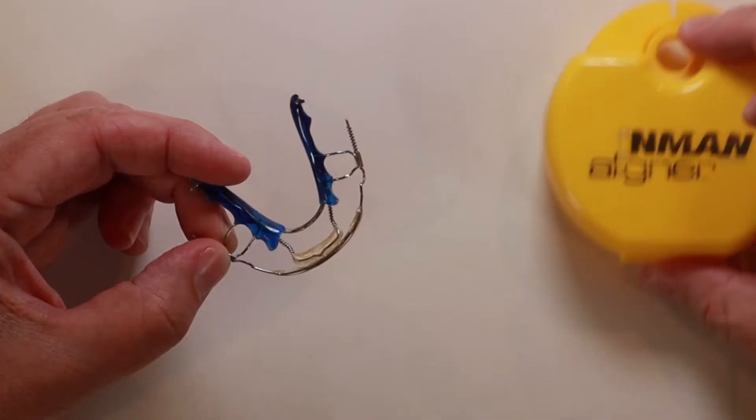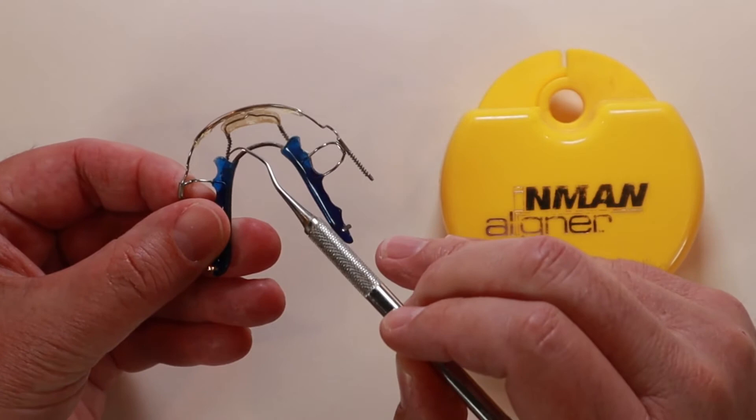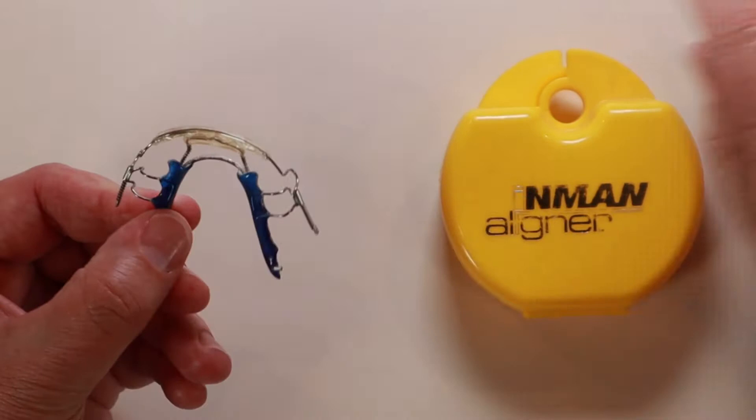Here's a close-up look at the aligner. It's made like a traditional acrylic and wire retainer, but the difference is the four springs attached to it. Two of the springs are used to push your teeth out towards your lip, and two springs are used to push your teeth in towards your tongue. The acrylic guides on the wires are used to push your teeth into the correct positions.